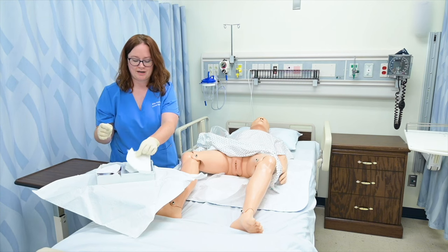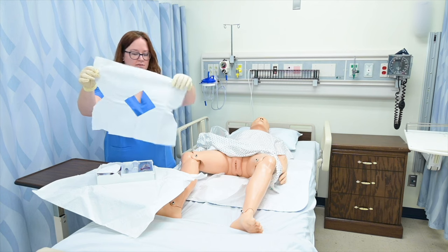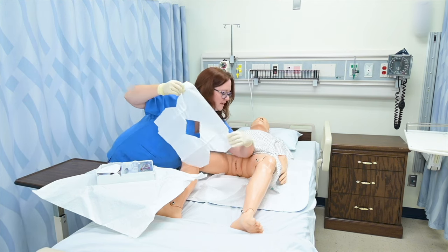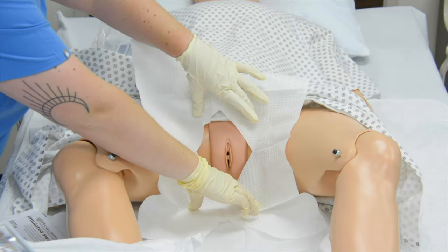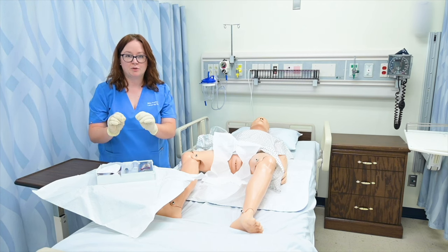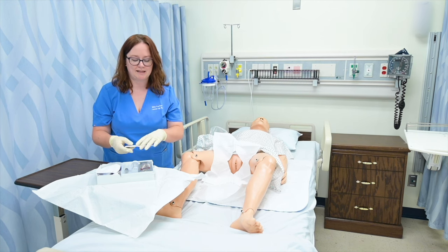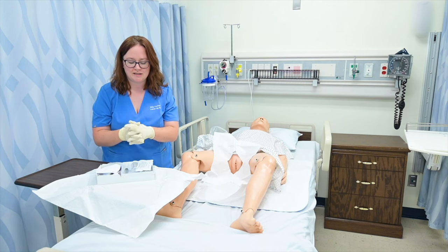Now I've got my fenestrated drape and I can place this over my patient's labia. Then I'm going to prepare my kit itself. They're simulated swab sticks because I can't put iodine on my patients, so we'll just pretend those came in my box. My kit has swabs, or sometimes they have alcohol and cotton balls.